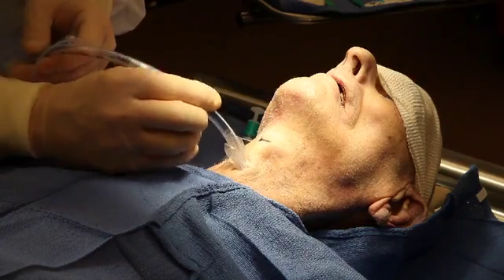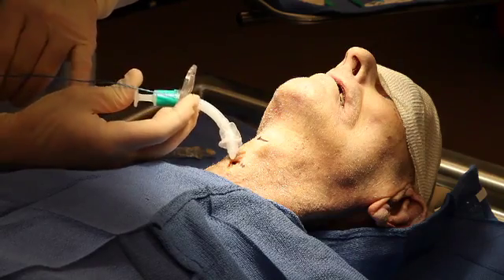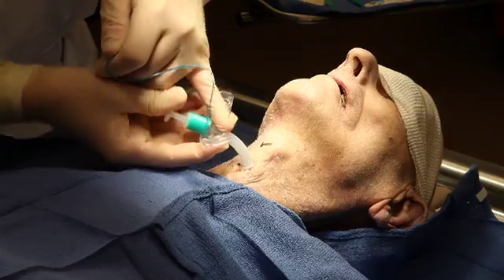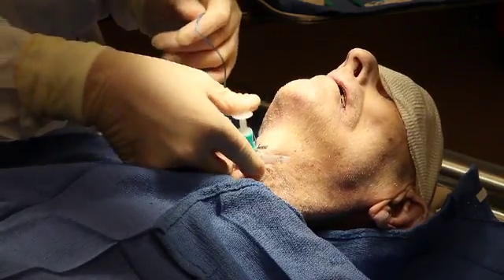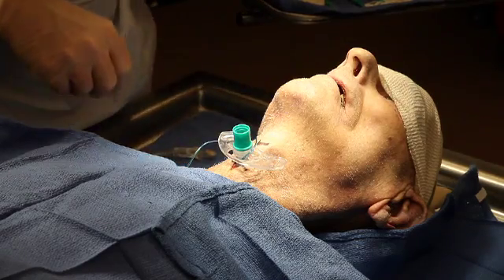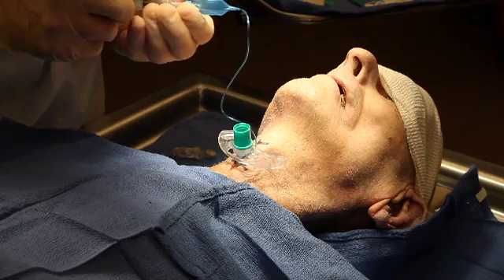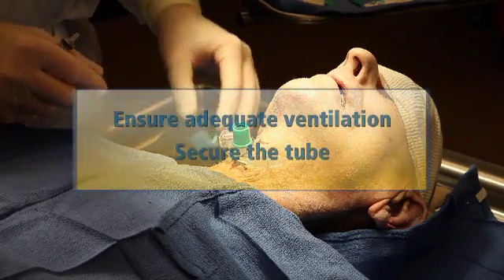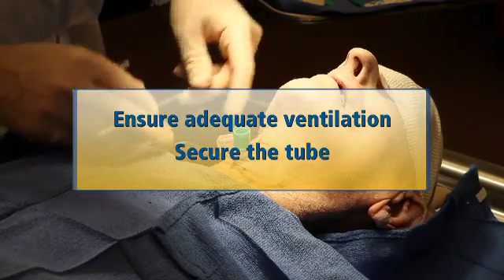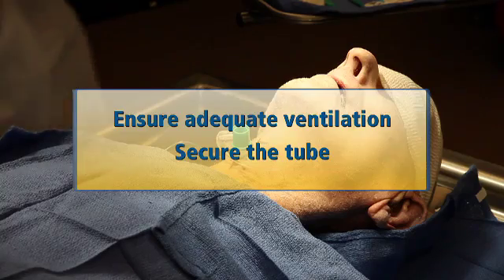An appropriately sized, cuffed endotracheal or tracheostomy tube, usually a number 5 or 6, is inserted into the cricothyroid membrane incision, directing the tube distally into the trachea. Inflate the cuff and apply ventilation to the tube, watch for chest excursion, and auscultate the chest for evidence of adequate ventilation. Finally, secure the endotracheal or tracheostomy tube to the patient to prevent dislodging.